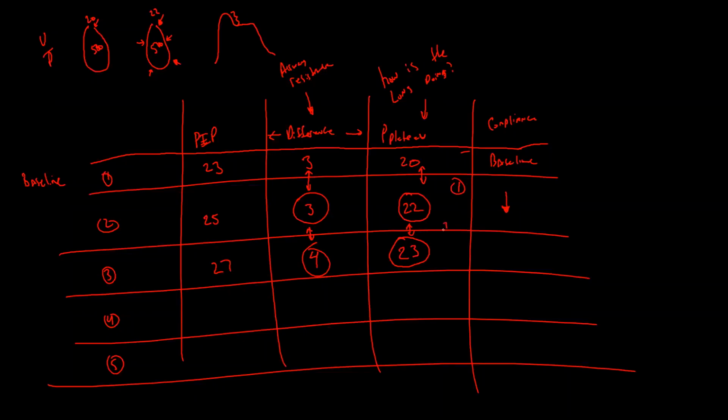This is step number 1 right here. This is step number 2 here. But before you can do step 2, you need to see what the difference is between your peak pressure and your plateau pressure. So you should not let the peak pressure, the PIP, interfere with anything that you're thinking. What we're looking at is just the plateau and the difference. Because a lot of times having that at 27, you're thinking, oh, wow, what's the patient doing? That would throw you off. But in reality, all you really need to look at is your plateau and the difference.